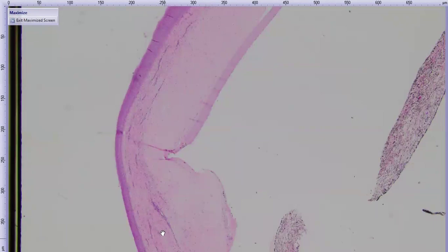So this denser or eosinophilic area, these are all areas of corneal stromal fibroplasia. People will call that fibrosis. I have no problem with fibrosis, communication-wise, but the corneal stroma is collagen to begin with. So fibrosis of collagen is a hard thing to wrap your mind around because it's already collagen. So fibroplasia means a different type of collagen is being deposited on the very surface along with the vessels. So let me go to higher magnification, show you that right away, and we'll be done with it.